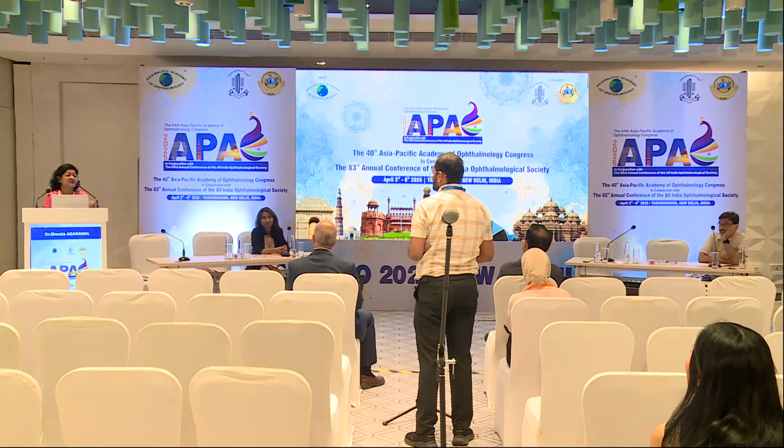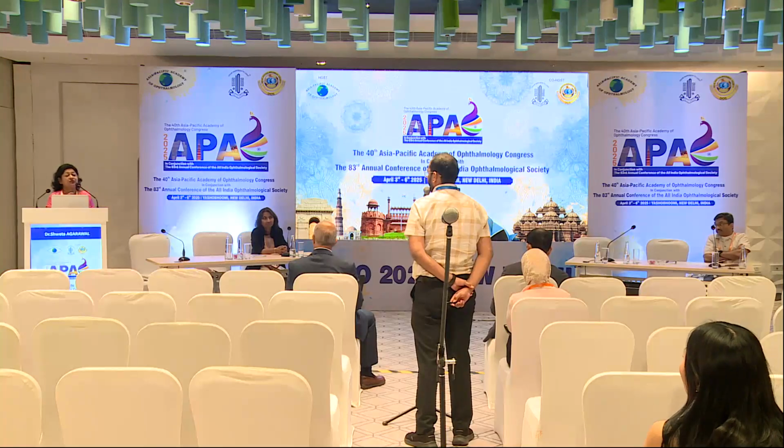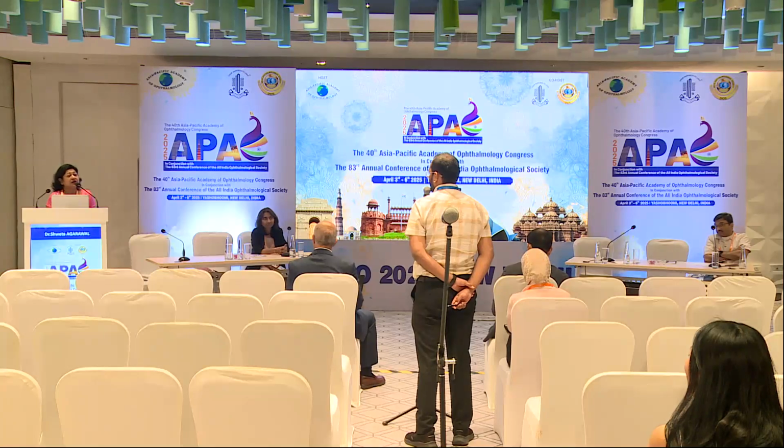In this patient was a case of chronic Stevens-Johnson syndrome, SJS some 5-6 years back, and we were trying to insert a Boston scleral lens. With the Boston scleral lens, her vision was improving from 6/60 to 6/18. So that was the reason that we were doing it. So in those cases, you don't really need any oral immunosuppressive therapy because we are dealing with a chronic SJS. In that case, any topical steroid like we use for the others, a dexamethasone is good enough.